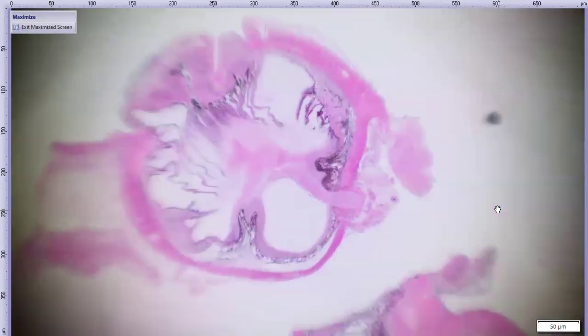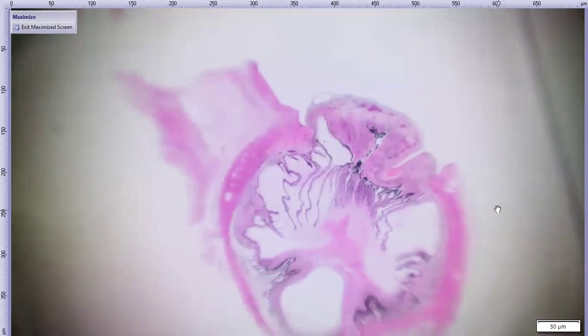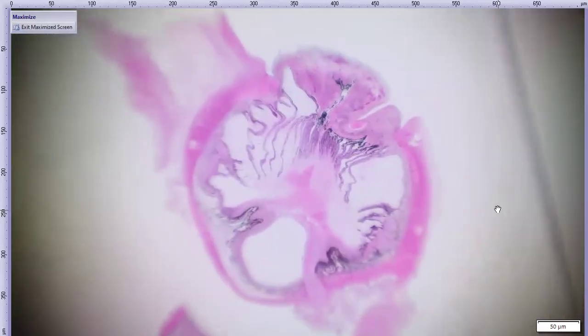Ta-da! What a cute little button. Here it is, all in one field. So here's our optic nerve right here. This is retina kind of coming in through here, but it's hard to even make out. We'll look at it closer. We've got tapetum here and this sort of folded choroid, just like we saw grossly. We do have essentially no cornea here, and all of this tissue is looking like iris, and we'll look at that closer in a hot second.